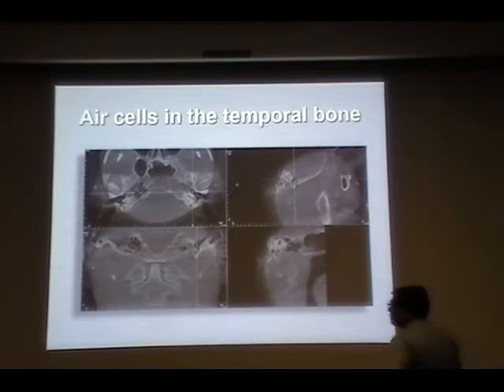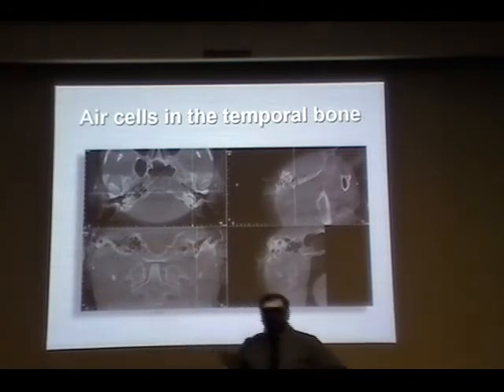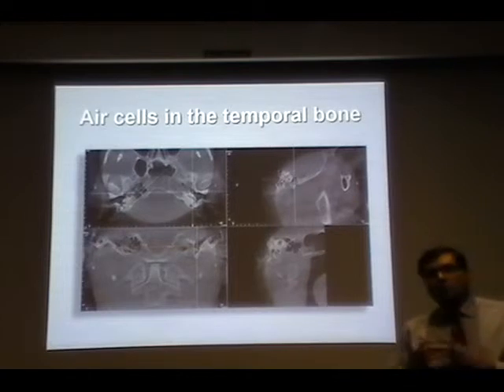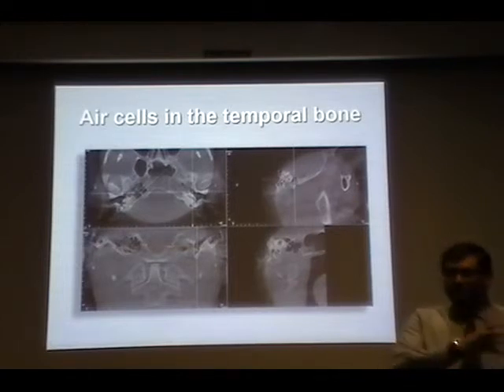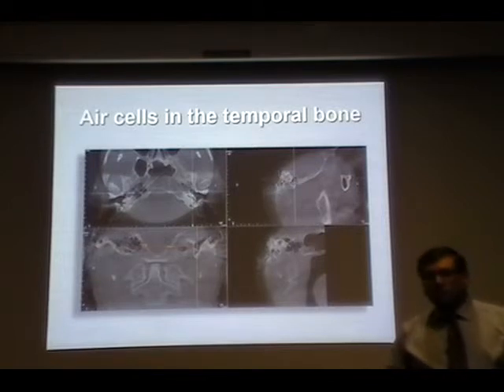In the temporal region, you are going to encounter some air cells. Those are not any pathology, and that's not a cyst, basically. So, normal air cells. You should know the head of the condyle, how it looks. And there are some normal cells in the temporal region.